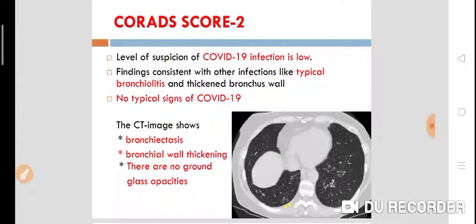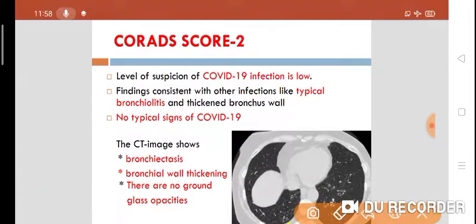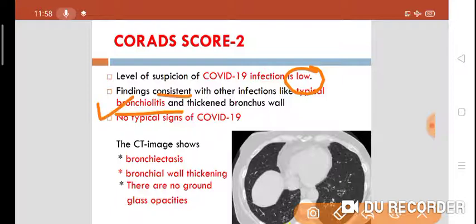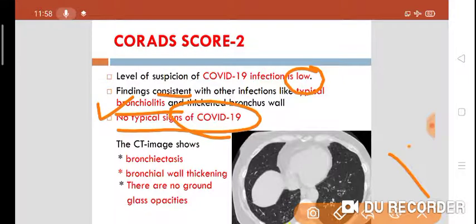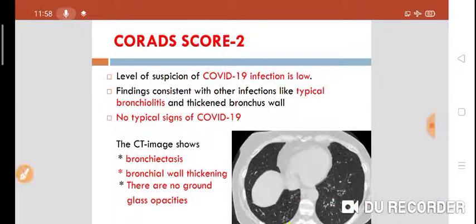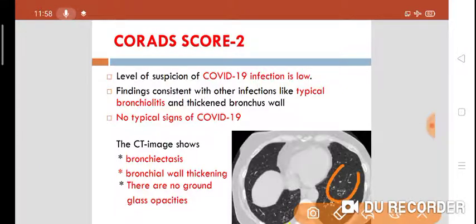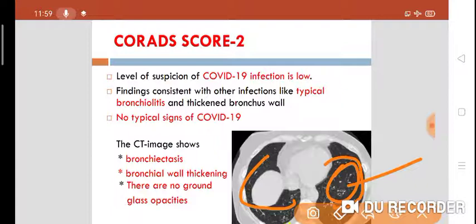CO-RADS score 2 means the level of suspicion is still low. Findings are consistent with other infections such as typical bronchiolitis or thickened bronchial walls, but there are no typical signs of COVID-19. On CT, there is bronchiectasis with thickened bronchial walls and no ground glass opacities, so the level of suspicion remains very low.